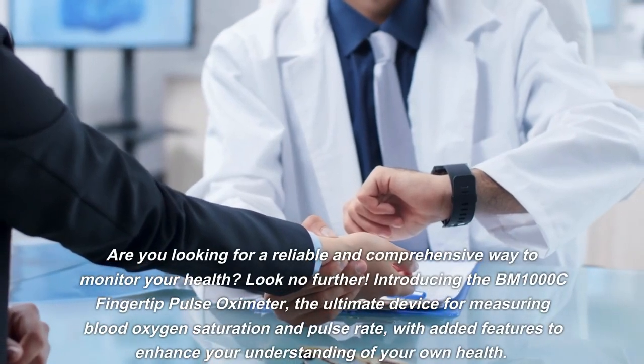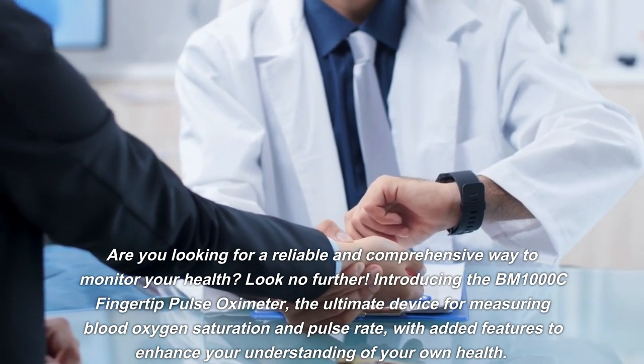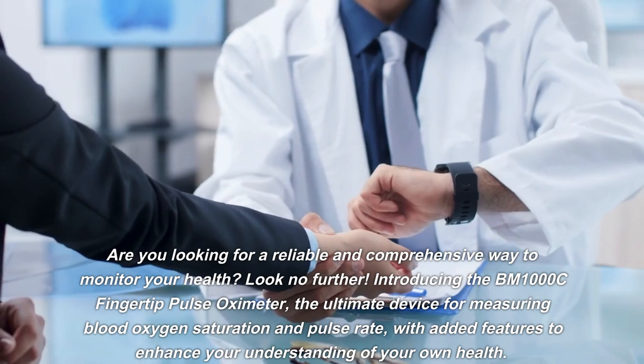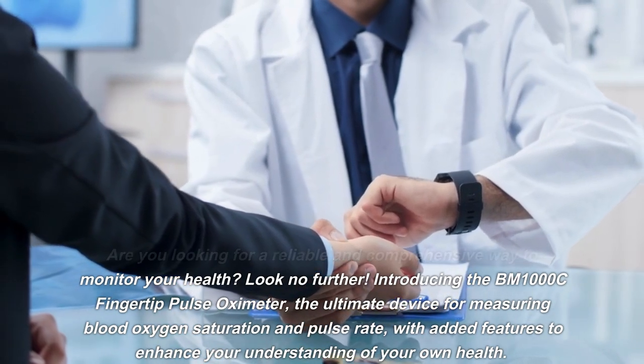Are you looking for a reliable and comprehensive way to monitor your health? Look no further — introducing the BM1000C fingertip pulse oximeter, the ultimate device for measuring blood oxygen saturation and pulse rate.